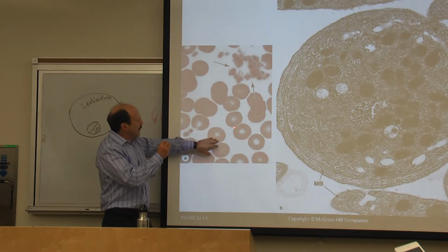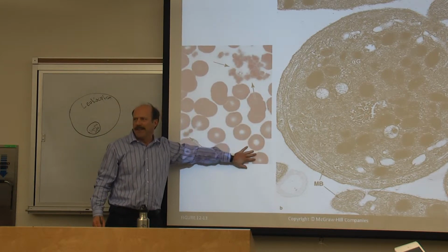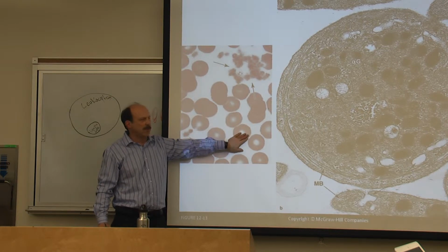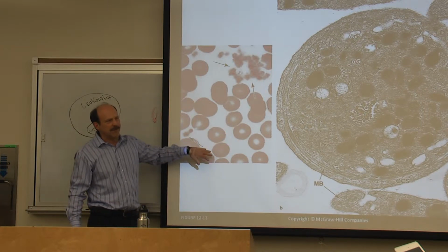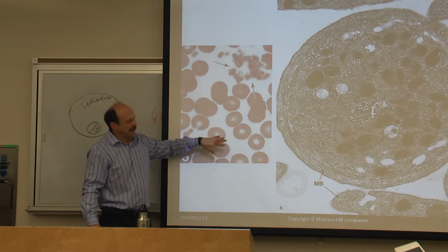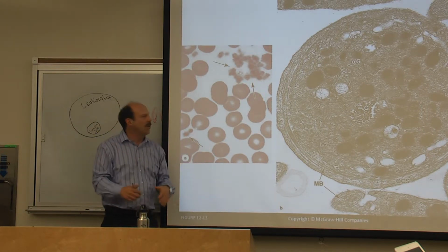Again, for our point of reference, this is the erythrocyte. You guys are going to be looking at a lot of slides, and this is going to be on the first exam: pictures of blood. You can tell that this is blood because the cells are free in solution, and they're kind of round. When they look donut-like, that's the red blood cell, the erythrocyte. If there's something bigger, it was either a granulocyte or an agranulocyte. The ones that are grainy are granulocytes, and those can be neutrophils, basophils, or eosinophils. If it's not grainy, then it's an agranulocyte, so it's either a lymphocyte or a monocyte. You guys should all know that.